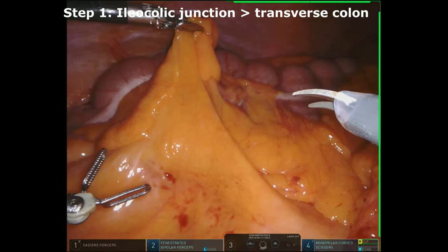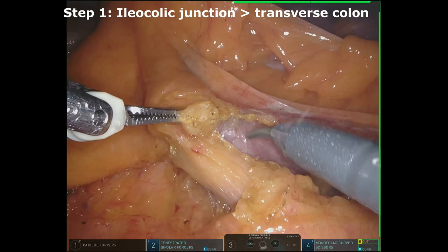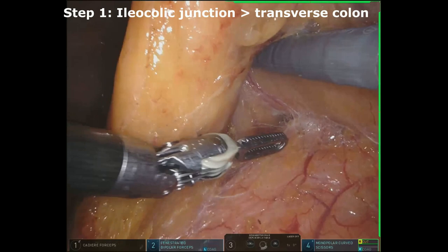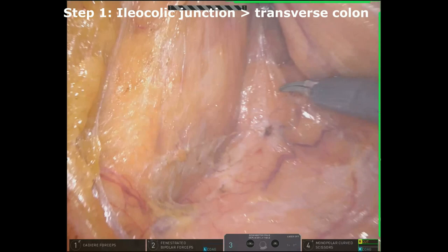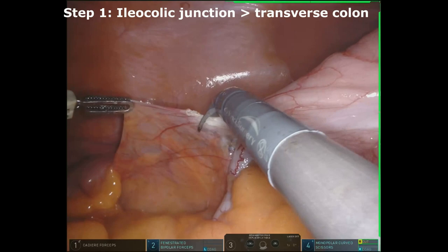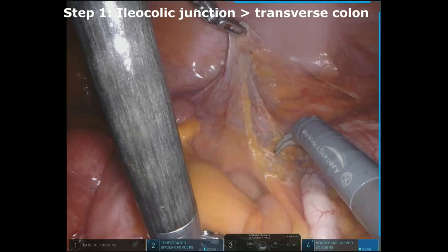After placing the cecum on tension, surgical dissection began with the vascular dissection. The ileocolic vessels were identified, lifted up, and carefully dissected. The ileocolic vein and artery were isolated and ligated with clips and then transected. A sharp dissection of the posterior visceral fascial layer from the Gerota's fascia was performed in a medial-to-lateral fashion. A two left hands conformation was first used, with exposition eased by a double fenestrated robotic grasper inserted through robotic arm one to retract anatomical structures. The detachment of the Toldt's fascia was completed taking down lateral attachments.